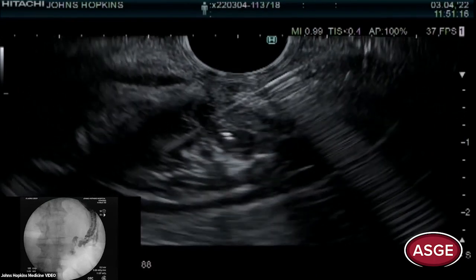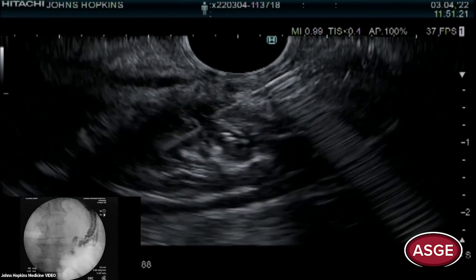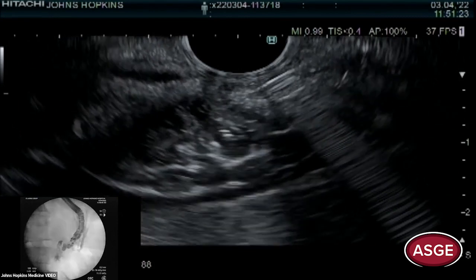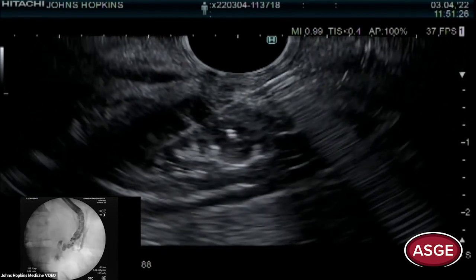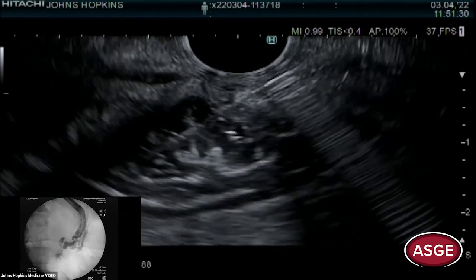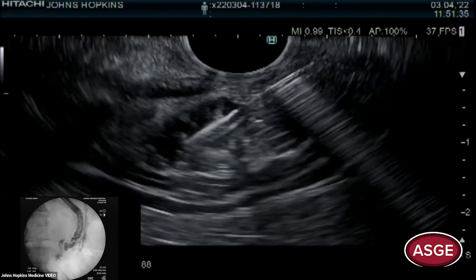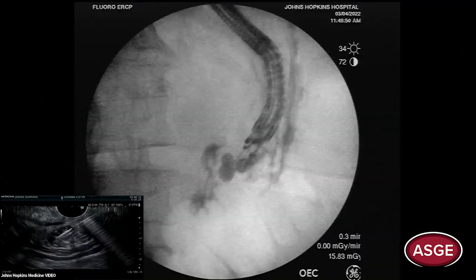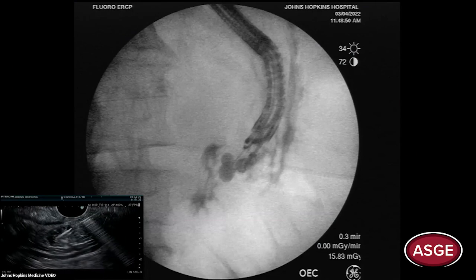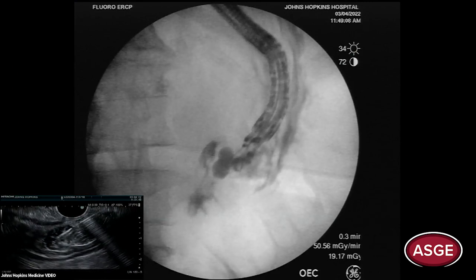The stomach is completely collapsed. We do a test injection live and can see contrast flowing into the stomach. I moved my needle — I just want to make sure we're still in place. You don't want to inject intramurally. We have a little bit of that, so we're going to make sure it's flowing into the lumen.